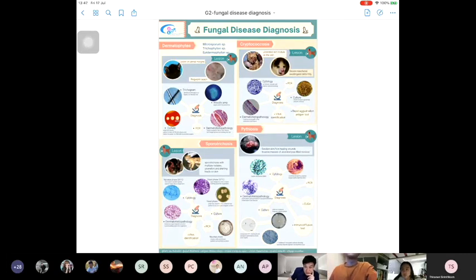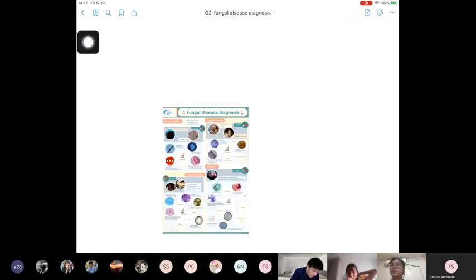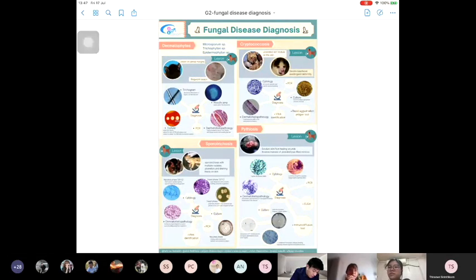Thank you. There are plenty of questions in the chat box. Can I ask you a question? I'm Atitaya Pintanon from Group 1. I want to ask about the Wood's lamp examination, about the percent of false positive, and if it is false positive, what are the possible reasons? For the false positive of a Wood's lamp, it can be caused by the vet wearing a white gown, which can show fluorescence too, and also soap residues on the patient's skin can cause a false positive too. But I may look for the percentage of the false positive.